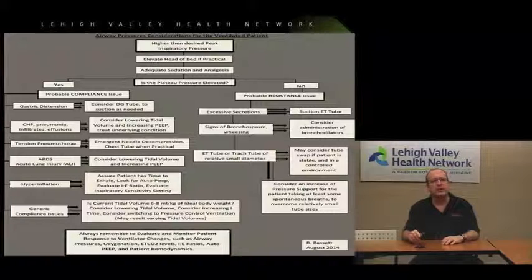Some of your more generic problems, when there's a compliance issue, maybe your tidal volume's just set too high. That happens sometimes. Sometimes it happens at some of the referring places we go to. They just have their volumes way too high. They might be set to 10 to 12 per ideal body weight. Maybe they set it to their actual body weight. So just evaluate where you're at for your tidal volumes.